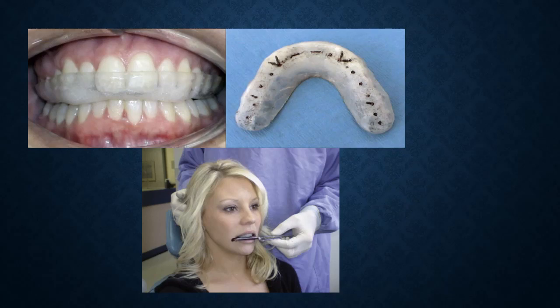Well, after complete adjustment of the appliance on the articulators, the device will be refined again inside the patient's mouth. So the patient is seated on the dental chair, and the operator uses articulating tape and a handle to guide the mandible into the retruded contact position, protrusion, and to the working side from the right and left.